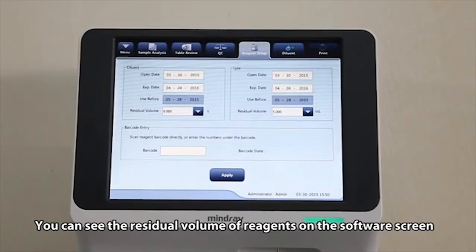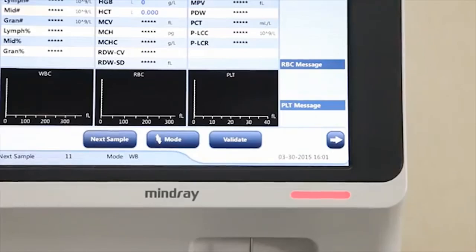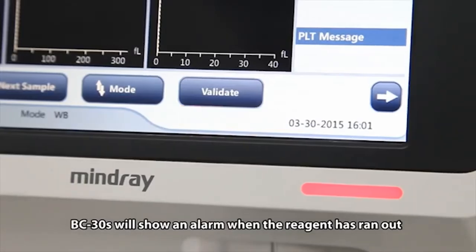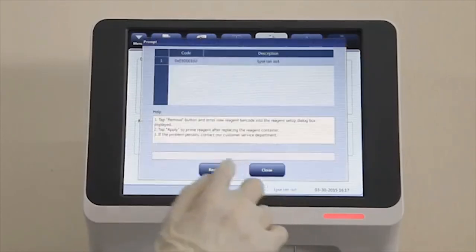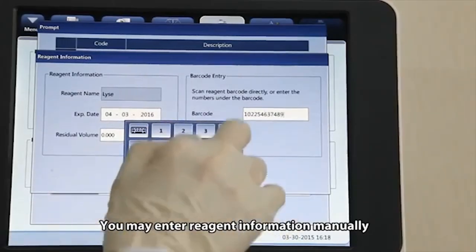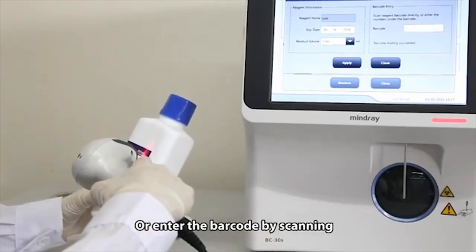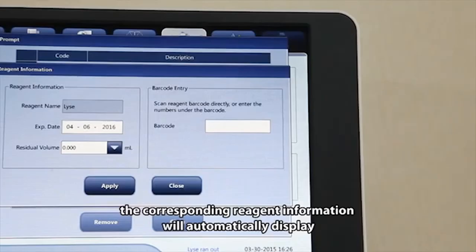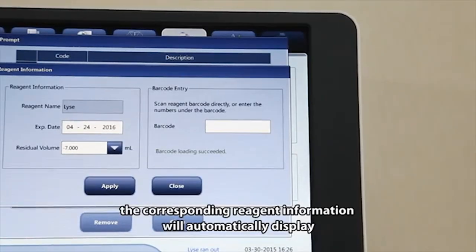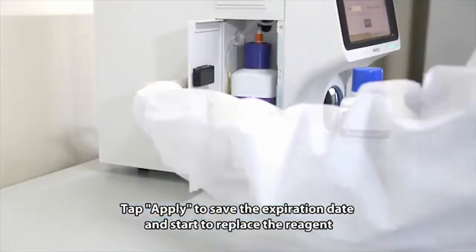You can see the residual volume of reagents on the software screen. BC30S will show an alarm when the reagent has run out. You may enter reagent information manually or enter the barcode by scanning. If the barcode is valid, the corresponding reagent information will automatically display. Tap Apply to save the expiration date and start to replace the reagent.